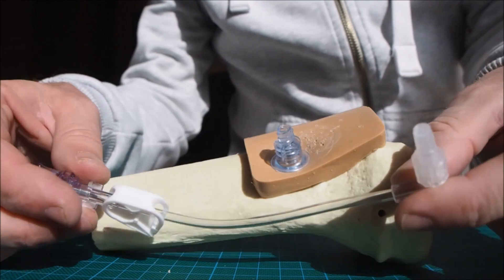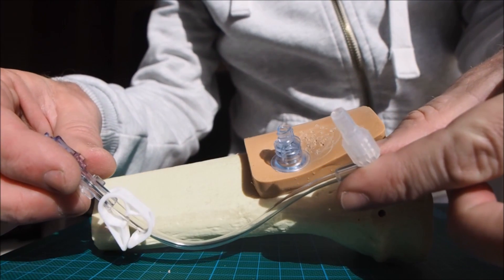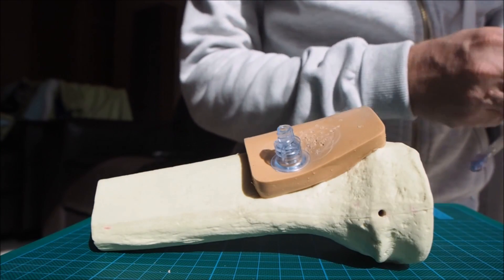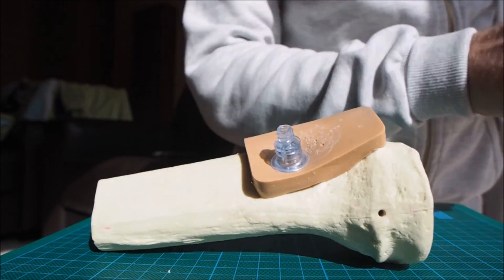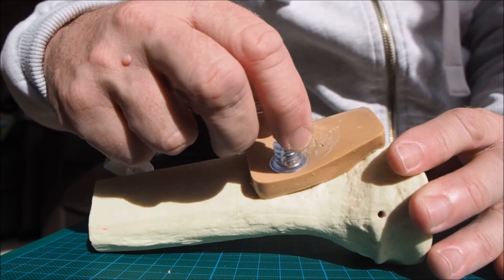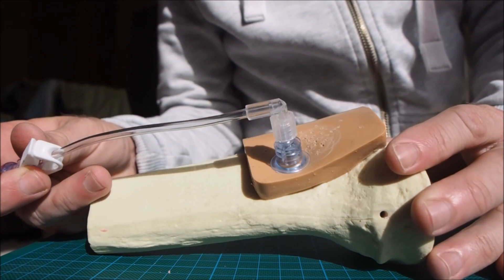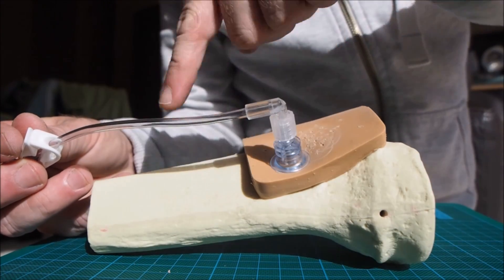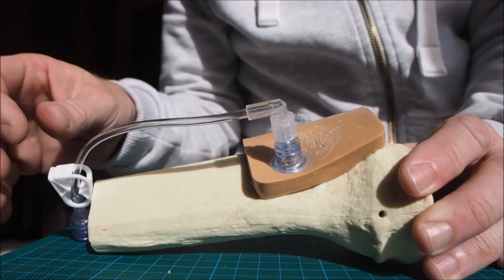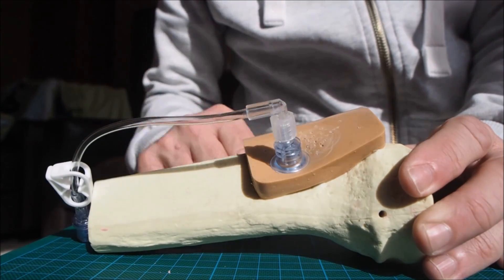Next, you take the tube that comes with the system — or if you've lost it, you can just use a standard giving set. Screw that firmly on there; it will have been primed, of course. The important thing is to secure this line to the leg, so we don't want this to come out. The main thing we want to do is make sure this is absolutely secure.